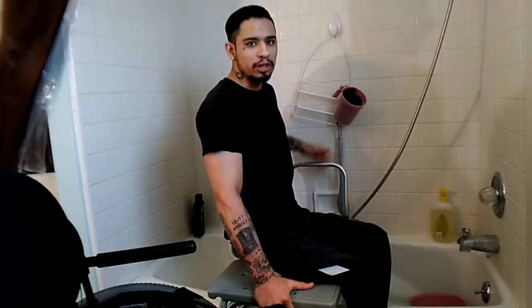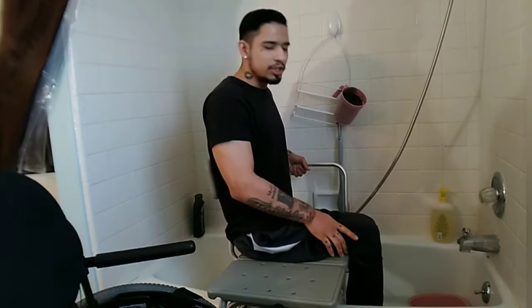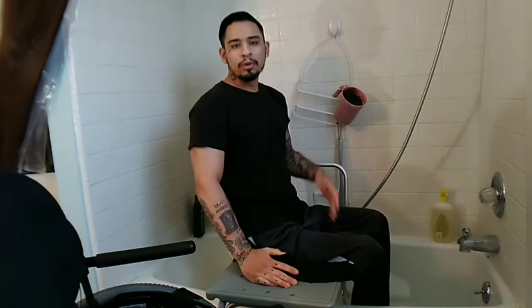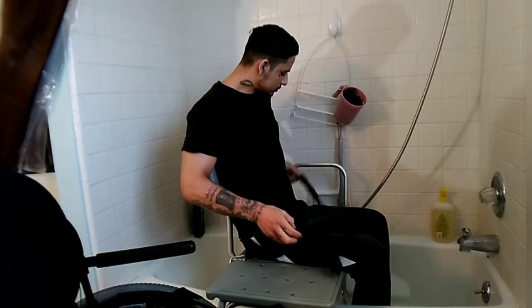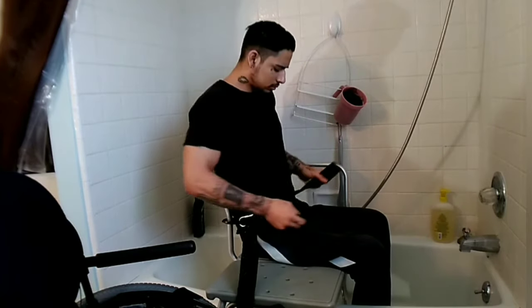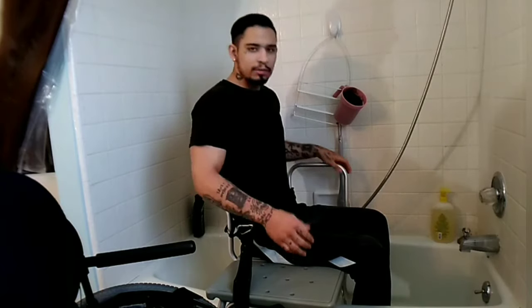For me, I have to hold on to something because I have no core balance. And then I just lift my leg and pull it over just like that. I also have one of these foot tubs so I can put my feet in. Then what I do next is put on my seat strap because I keep sliding down — it just helps when I'm doing my hair and stuff.